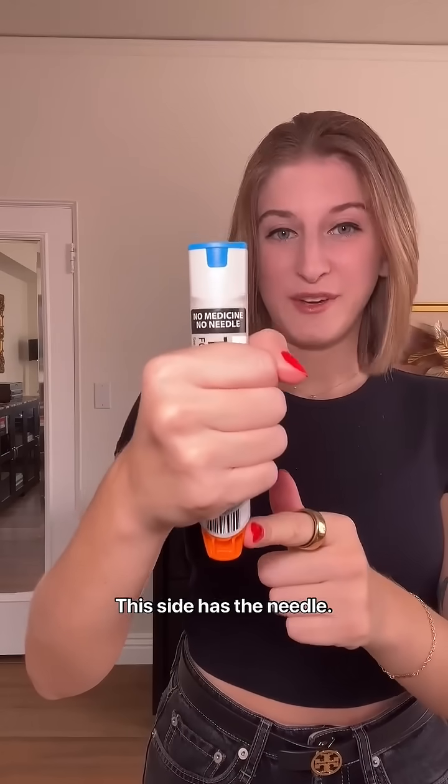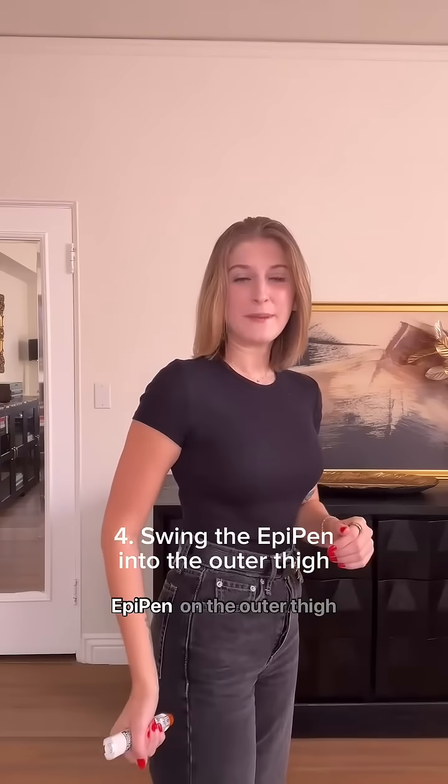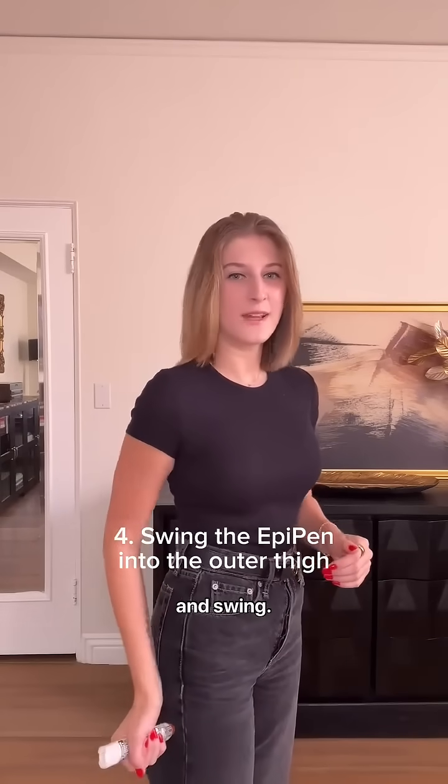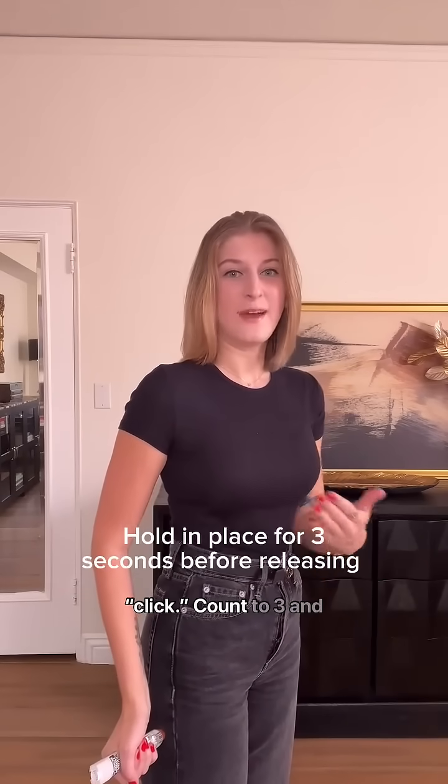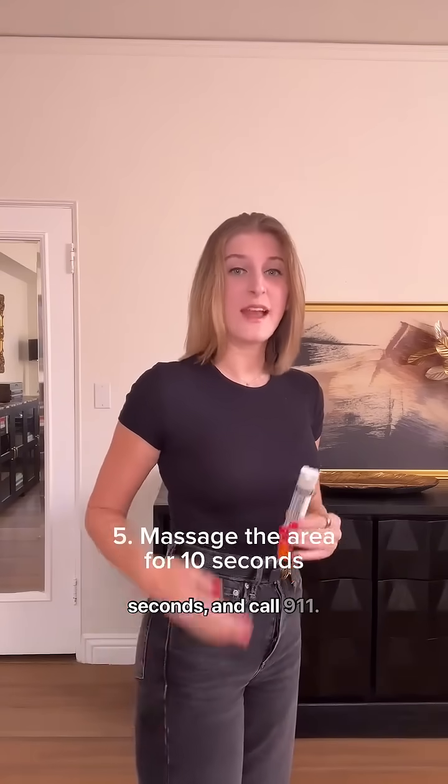This side has the needle. You're going to remove the blue safety cap by pulling straight up. Now you're going to place the EpiPen on the outer thigh and swing. Wait till you hear that click. Count to three and release. Massage the area for 10 seconds and call 911.